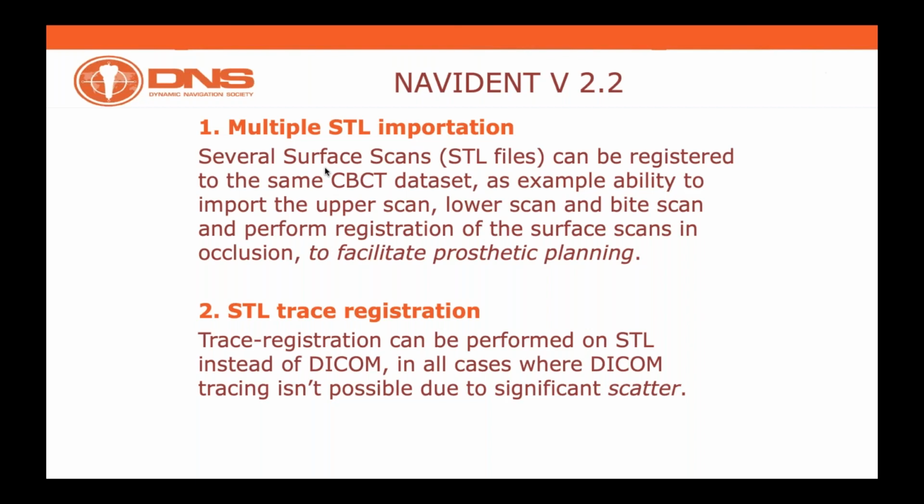We're doing that by means of a protocol which we call trace and place.